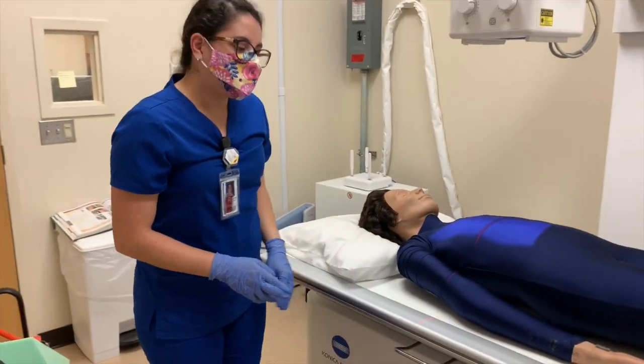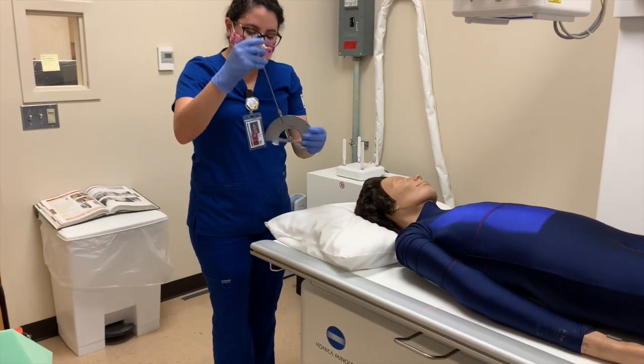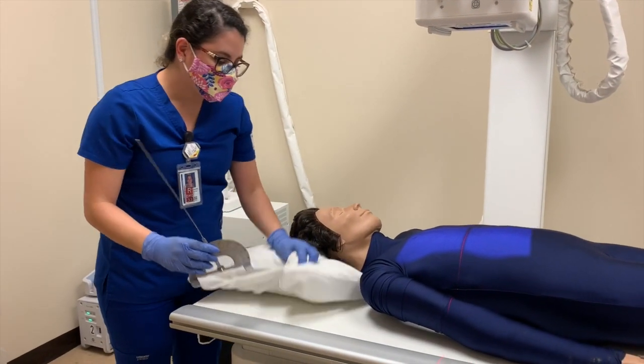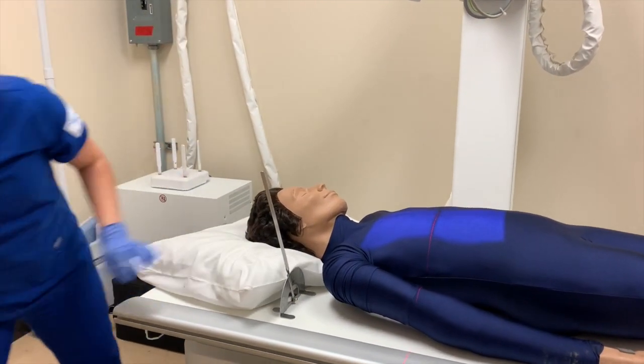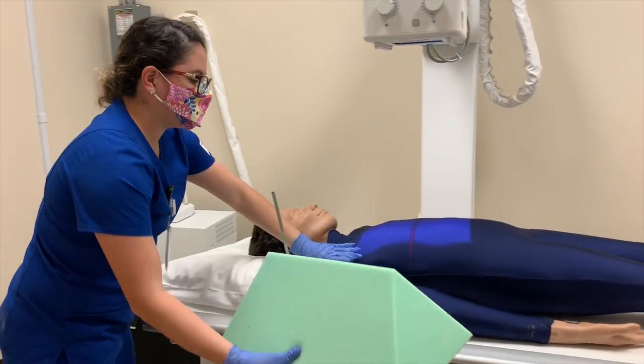Now to position the patient, we're going to use an angulator, and it's going to be 20 degrees from true lateral, which is 90 degrees. I'm also going to use a sponge to hold her in place.